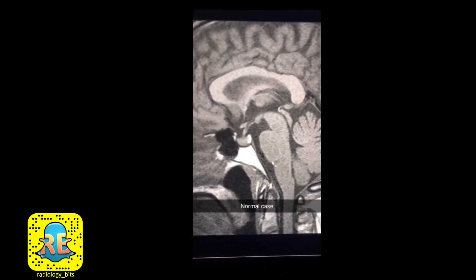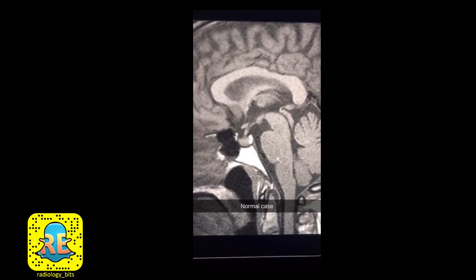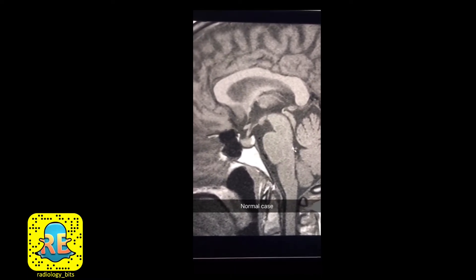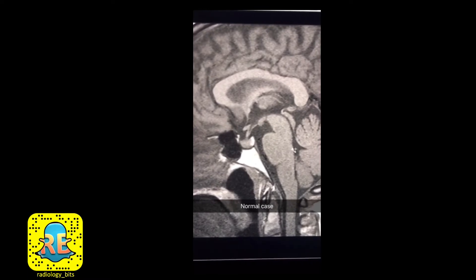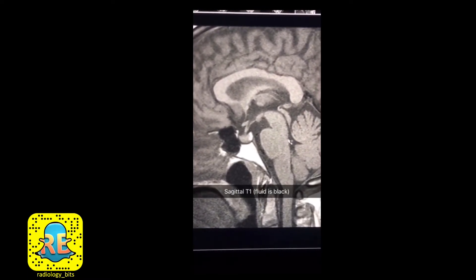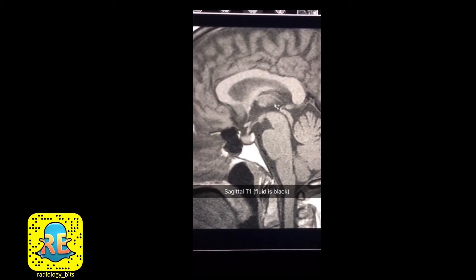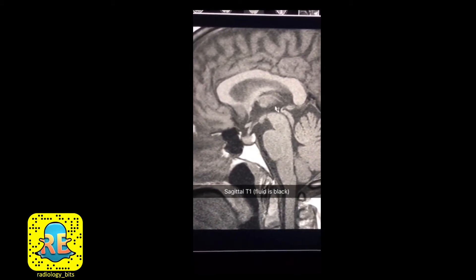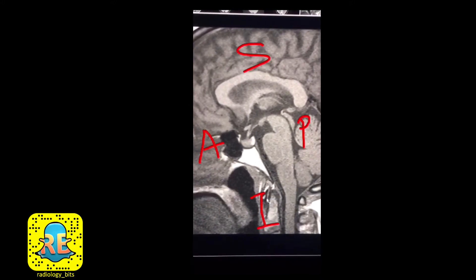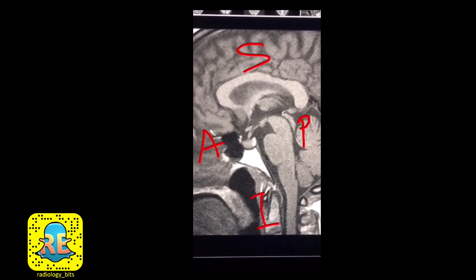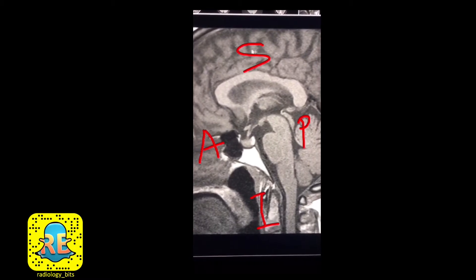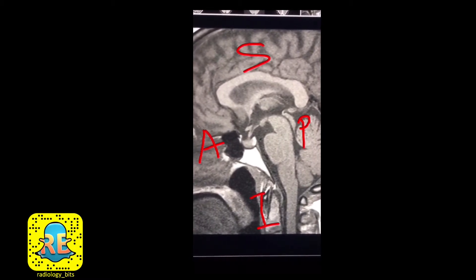Now that you saw the clip, let's go over a few normal anatomical points. This is a normal case, different from the case we started with. This is an MRI in a sagittal view — T1 weighted, meaning fluid is dark. A bit of orientation: this is anterior where the nose is, this is posterior in the back, this is superior at the top of the head, and this is inferior below.